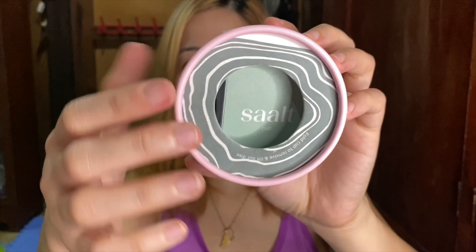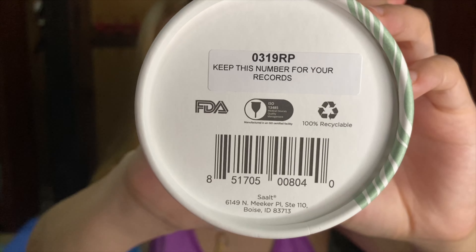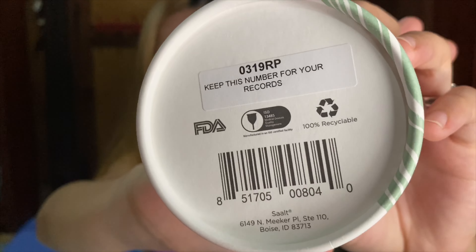Oh my gosh — nanonood na kasi ako ng mga videos on how to fold it, pero nagsistruggle ako, parang hindi kakayanin ang powers ng kamay ko. Oh my gosh, paano na ba ito guys, papatuloy pa ba tayo? Let's continue. Sa pag-open, makikita nyo dito na it is FDA approved and it's legit.